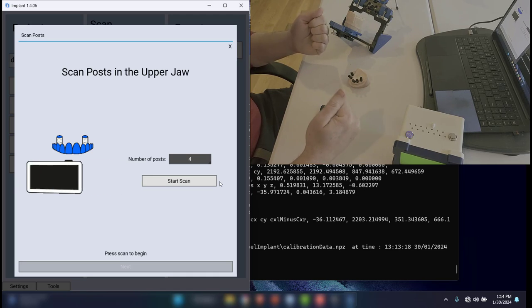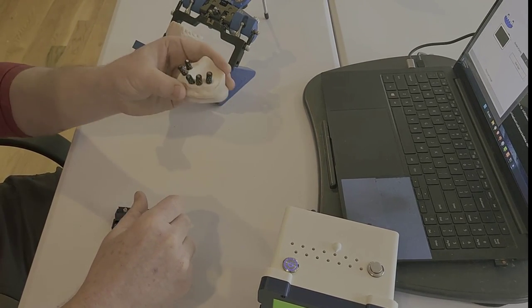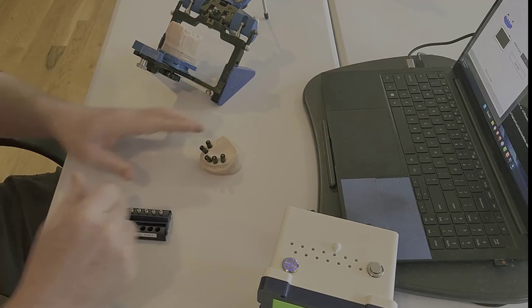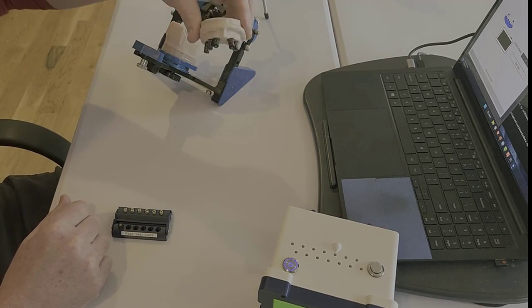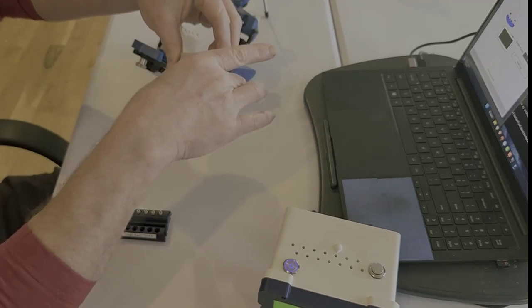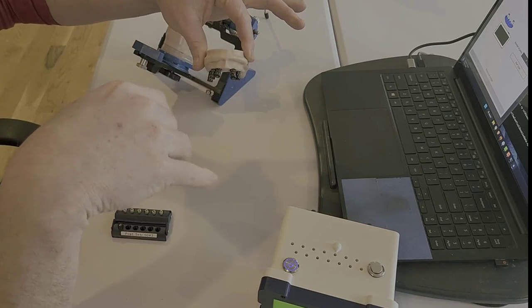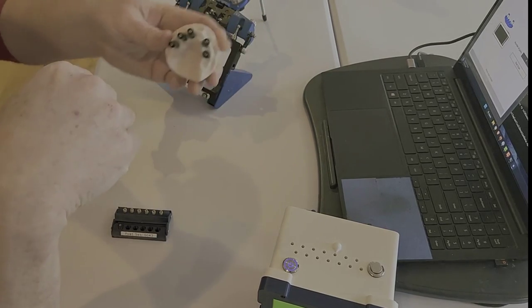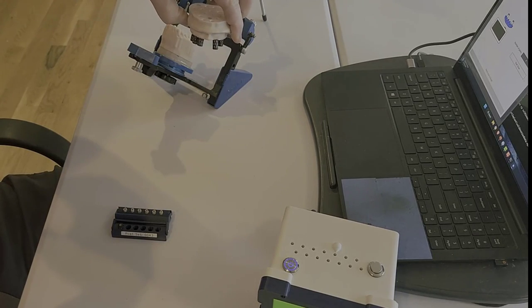And so I finally reached out and was like, hey, what's going on with this? And as it turns out, it's not going to read maxillary scan posts if they're oriented like this. Think about how it is in a mouth. This would be your patient's head, and the camera's coming in from this way. And so that was the only thing, is I had them oriented like a mandible, sitting like this, and I had told it I was doing a maxilla.